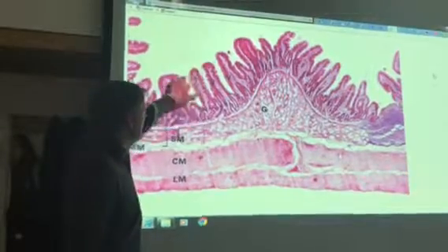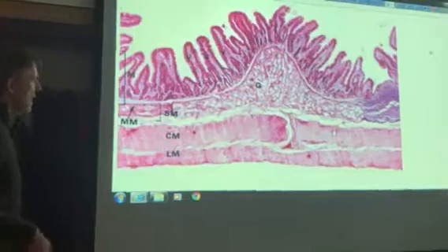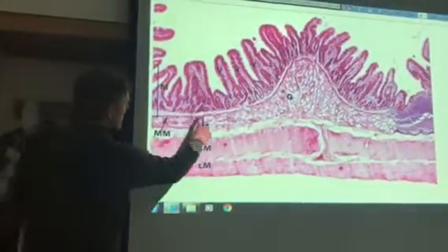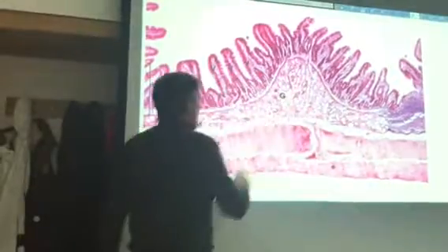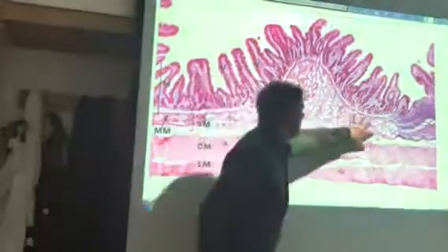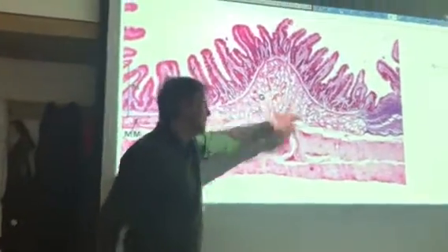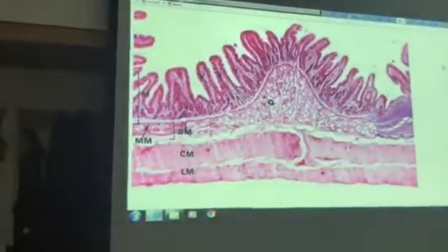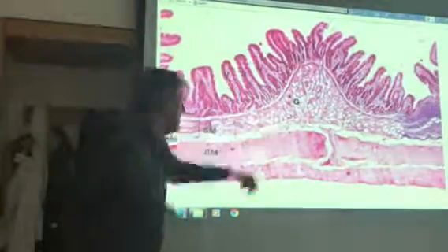So there's the epithelial layer. The stuff in the inside would be the lamina propria. It's pretty small, but this little line going across here would be the muscularis mucosae. All of this stuff inside here would be submucosa, specifically glands. That's what the G's for. There's a lot of glands in the duodenum. They actually have a name. They're called Brunner's glands. Okay, so that's what's there.